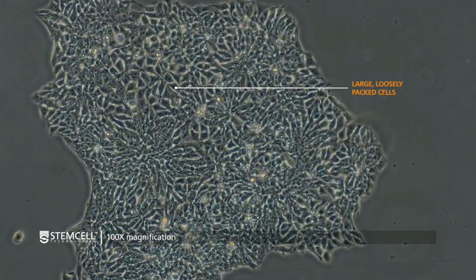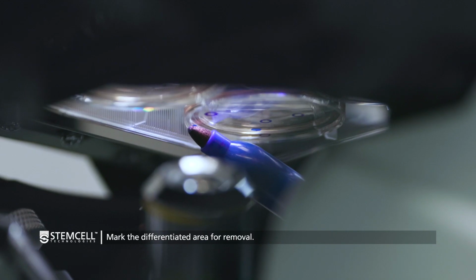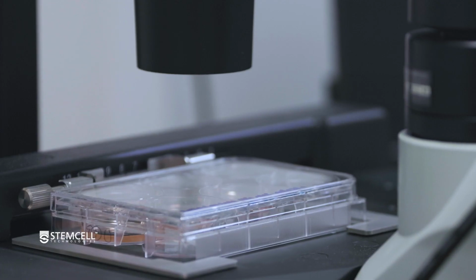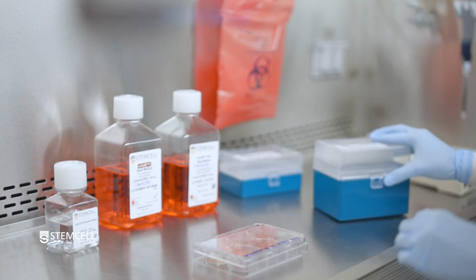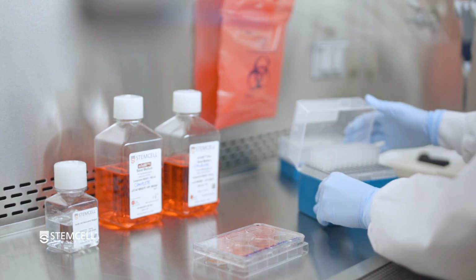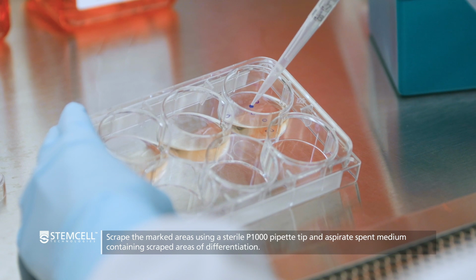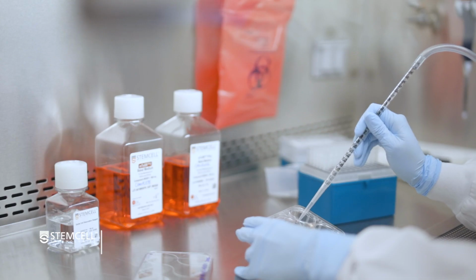Once you have identified an area of differentiation, using a microscope object marker or a permanent marker, mark the area on the underside of the plate. When the entire well has been assessed and areas of differentiation have been marked, move to the biosafety cabinet to begin passaging. Using a sterile P1000 pipette tip, scrape the areas of differentiation as marked previously, and aspirate the spent medium and the differentiated cells that you have scraped with the pipette tip.